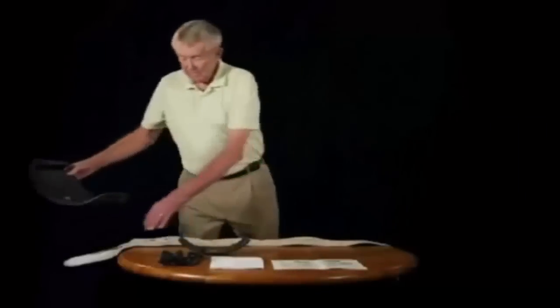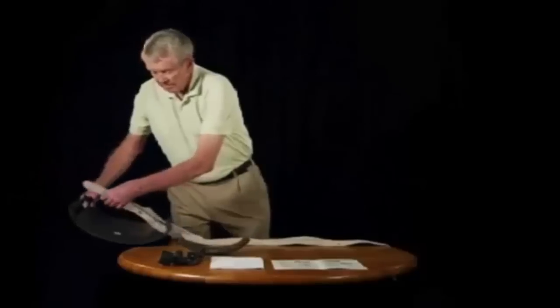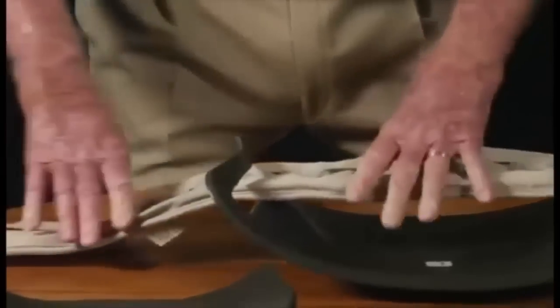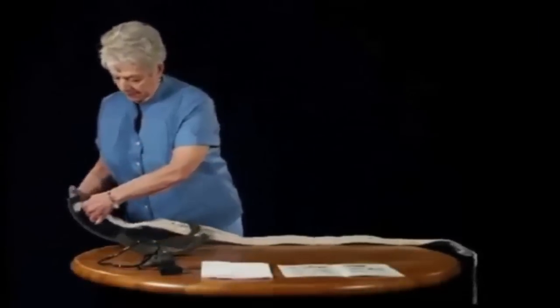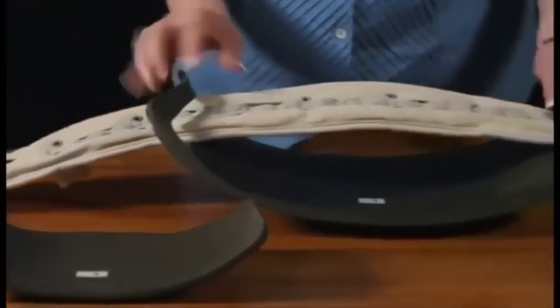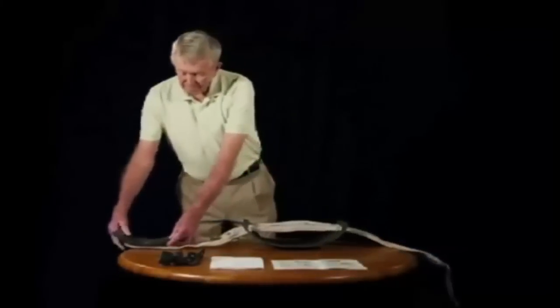To use the back panel, just thread the Back Traction Belt through the panel, then insert the front panel. Next, add the front panel by attaching it to the Velcro strap on the belt.